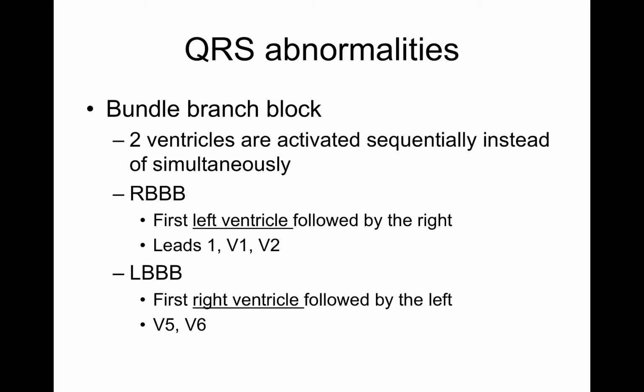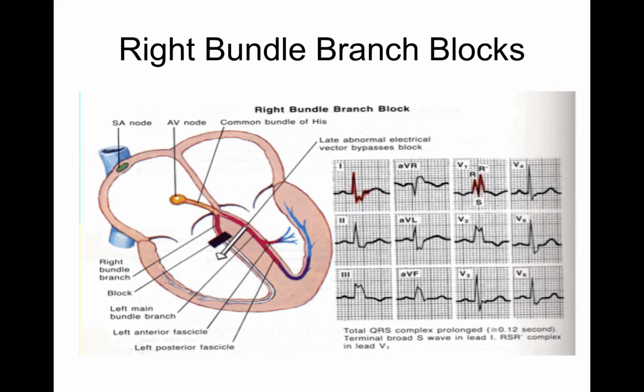I'm not going to get into much detail other than you recognizing what is right and what is left, okay? So when it comes to a right bundle branch block, here's what I'm going to do. You're sitting in your car, driving, wearing your seatbelt, and you're going to make a right-hand turn.